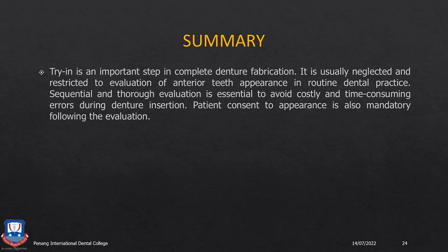All these things can be avoided by a proper thorough checkup during the try-in appointment, and adjusting and correcting those things at that time, instead of having to fabricate a new denture, or to reline or rebase the denture, or to again remove the teeth and do a new setup on the denture which you have just delivered.